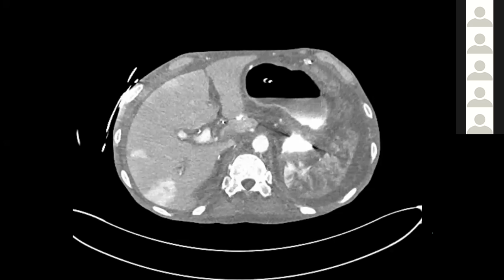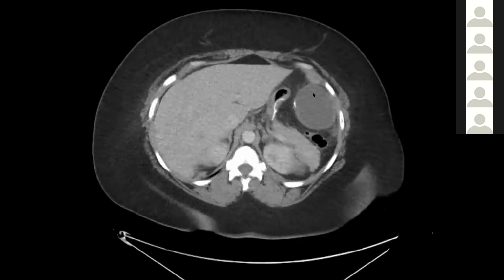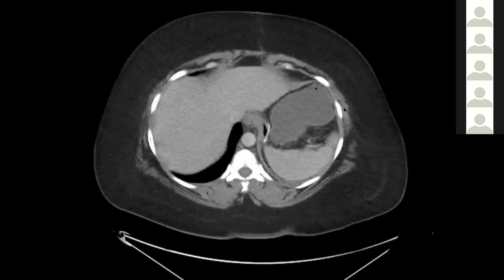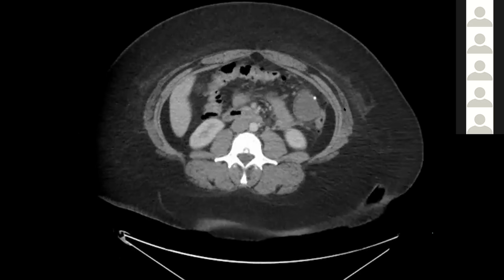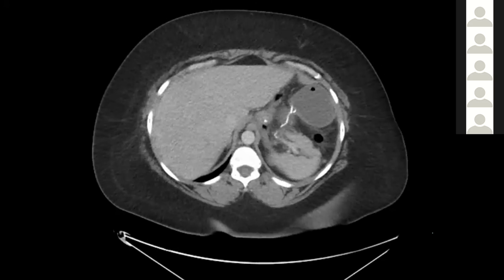Okay. And then I have one more case. Yvonne, actually, this is the one I sent you guys. So this patient had a sleeve gastrectomy and they're now having left upper quadrant pain. Did they forget to remove the stomach, or is it just an excluded stomach?